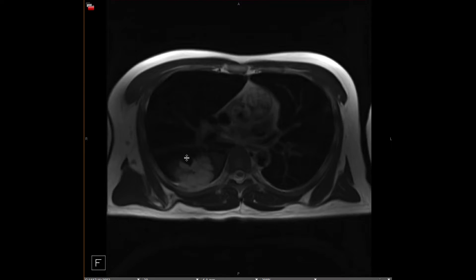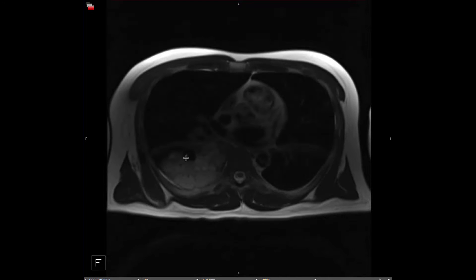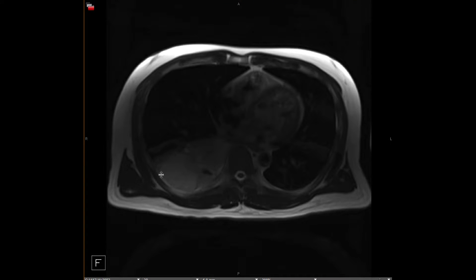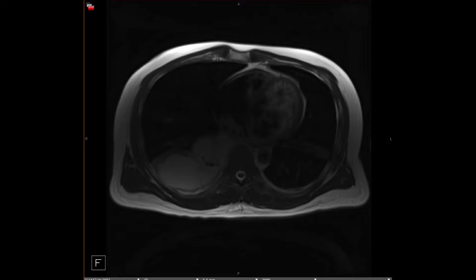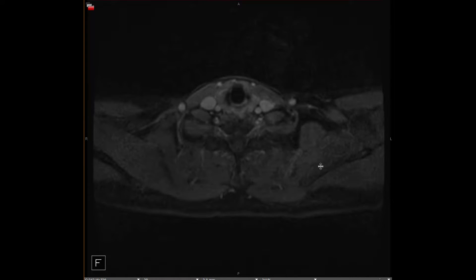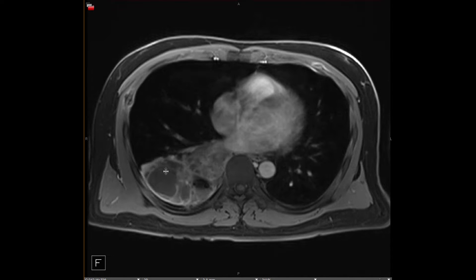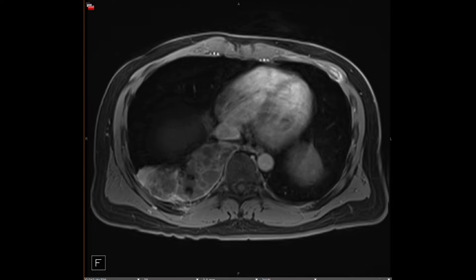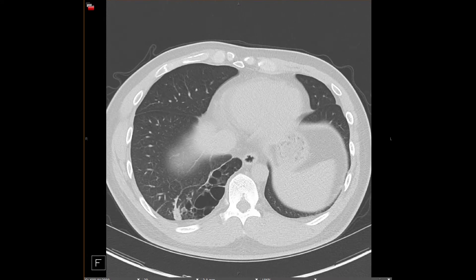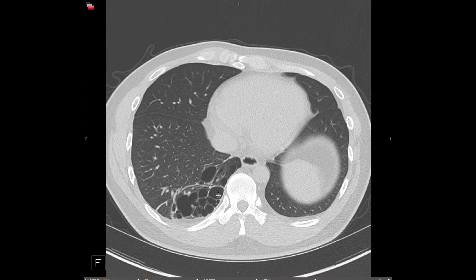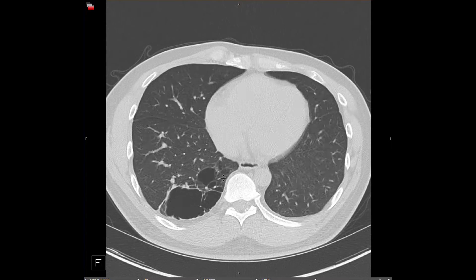The MRI demonstrates the internal fluid intensity on T2-weighted images, and post-contrast imaging demonstrates thin septal enhancement but no nodular enhancement. The patient was believed to be infected at this time, and then came back for repeat CT, at which point all of that fluid had basically resolved.